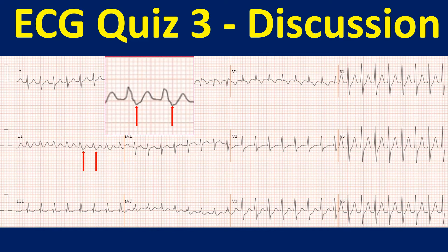Close scrutiny of the tracing shows probable negative P waves after the QRS complex in lead II, marked by a red arrow. These are called pseudo S waves, produced by retrograde P waves.